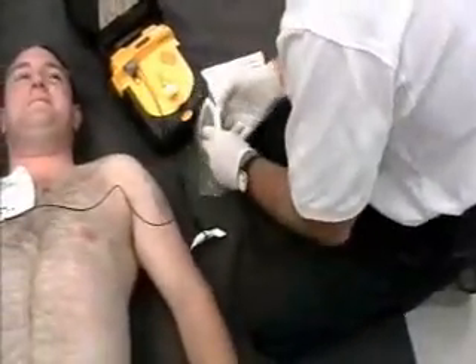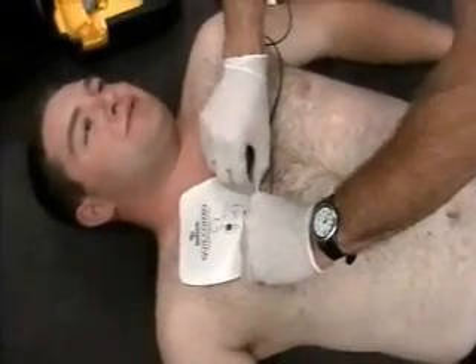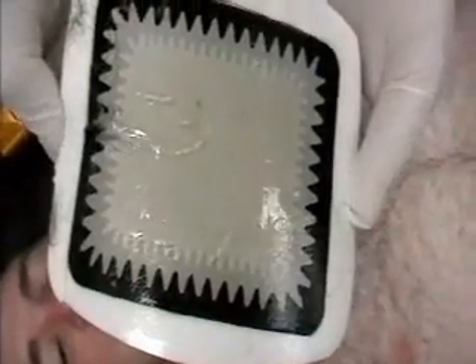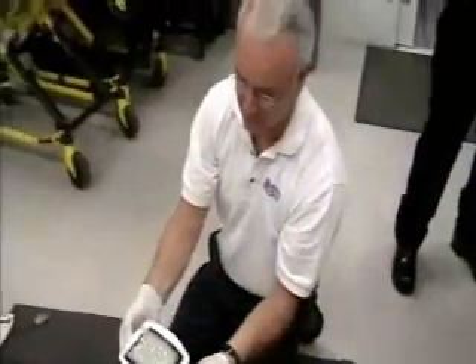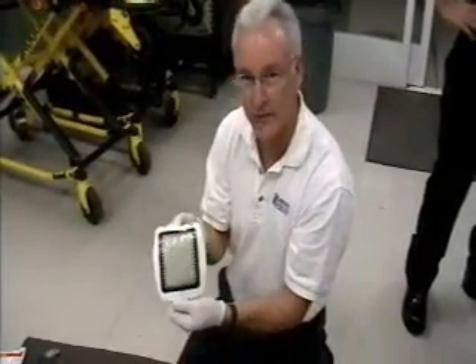So let's get the other one. We're going to go from the bottom up. One, two, and three. And I'm seeing just a little bit around the periphery as well, but not in the center. Which is really showing that the adhesive gel in the center is more for contact and not so much for sticking to the hair to be able to remove it, as has been taught by a lot of manufacturers and by classes as well.